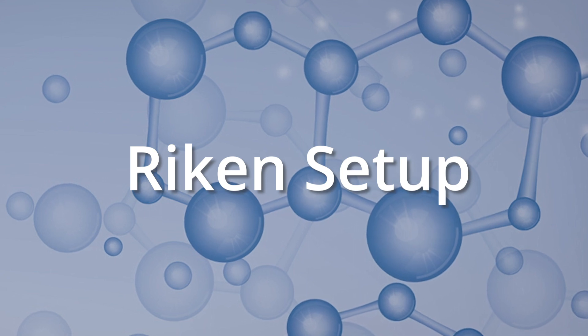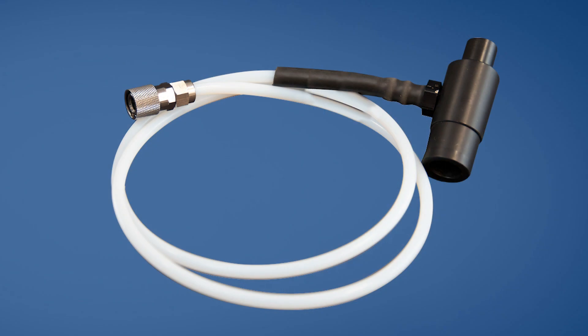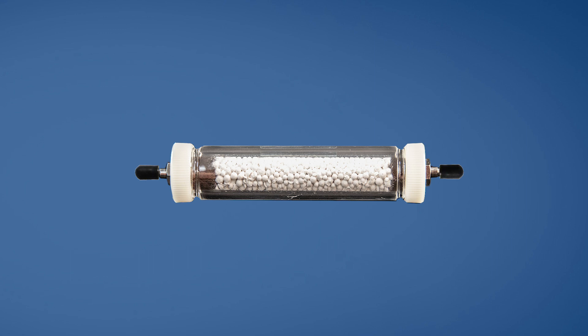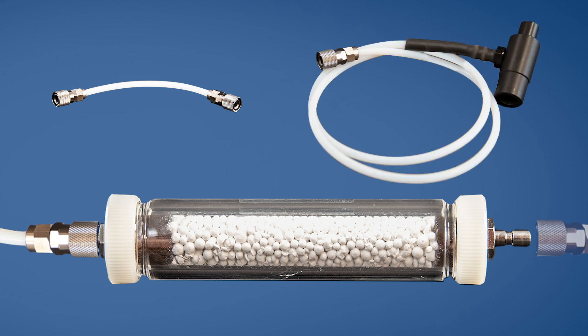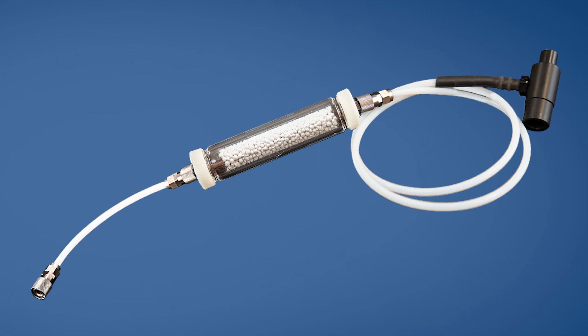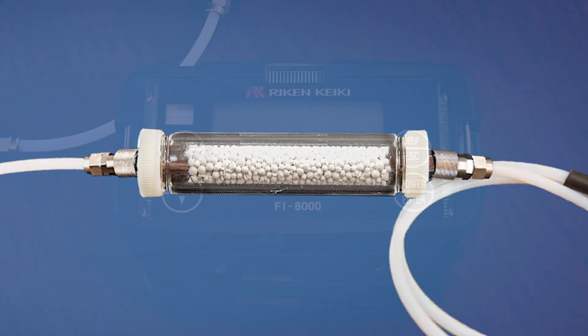Before connecting the Riken accessories for use, take time to inspect the tubing to make sure the line is not bent or kinked, as this can impact the readings. Before attaching anything to the calcium chloride absorption cylinder, remove the protective black rubber caps from either side. Once removed, attach the 6-inch filter tube to the left side and the 3-foot sample tube to the right side of the calcium chloride cylinder. These connected parts complete the whole sample line for the FI-8000P. Make sure the quick connects are securely locked in place.